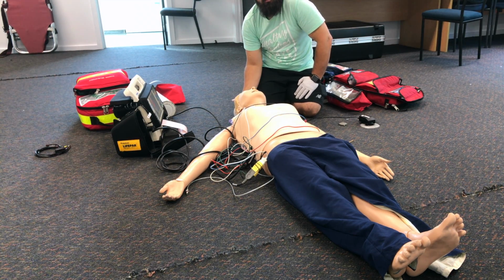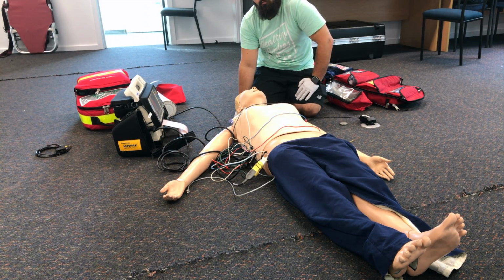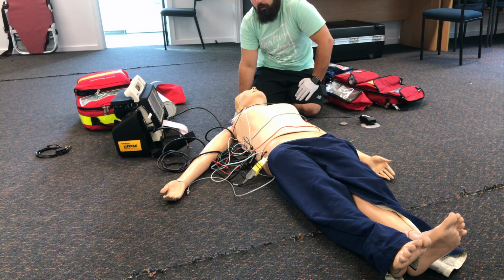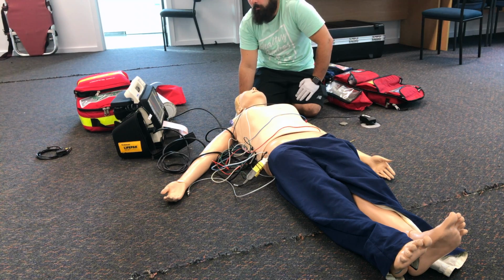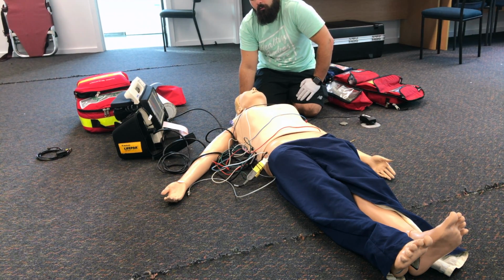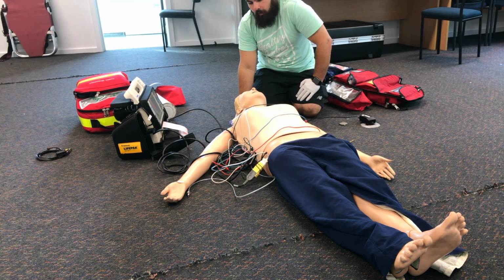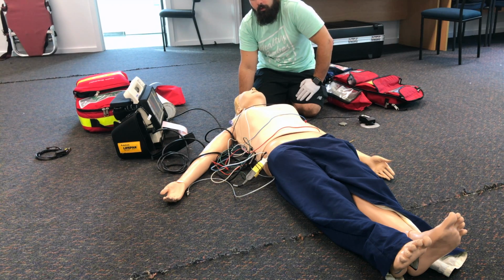If this patient was a narrow complex bradycardia and wasn't so compromised, we could consider 0.6 milligrams of atropine. But because this patient's so compromised and because he's got a wide complex bradycardia, that suggests a ventricular rhythm, which is more likely to be responsive to the adrenaline or the pacing. And in this case, we've gone with the pacing.